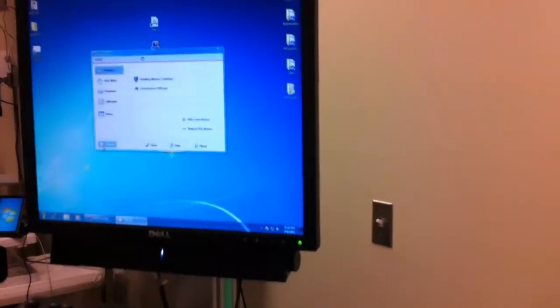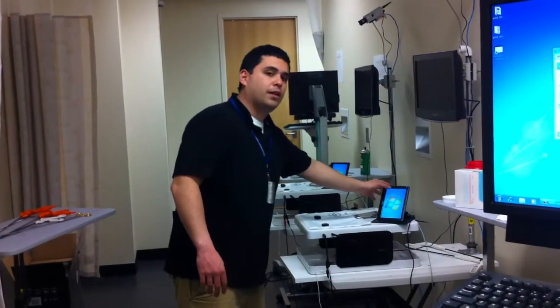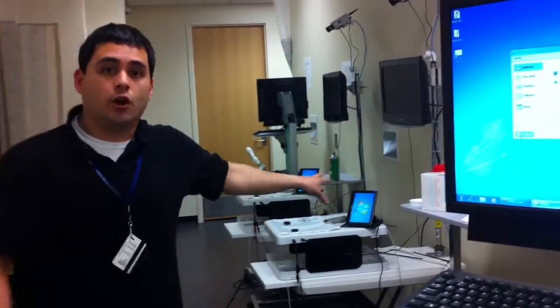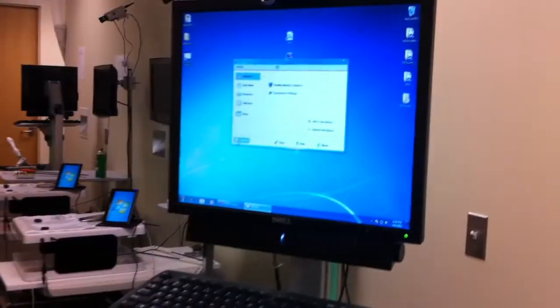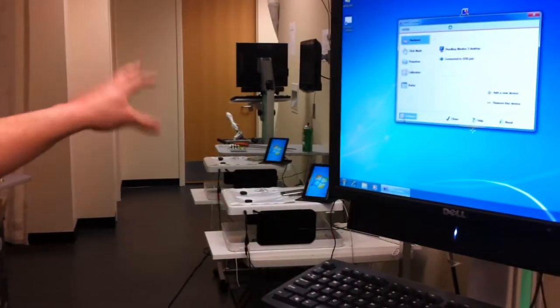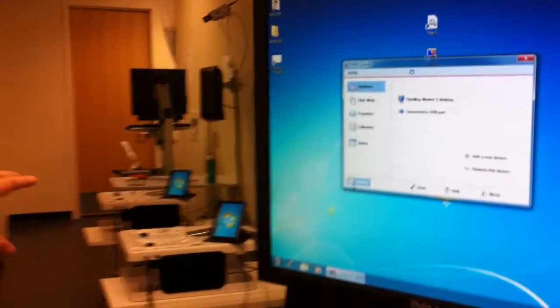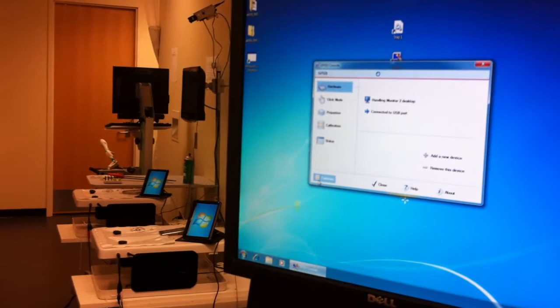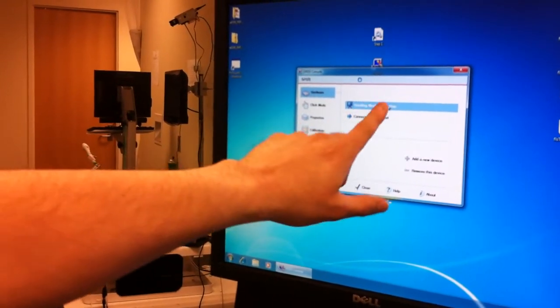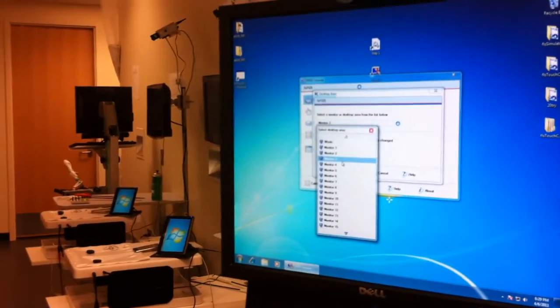You heard it click. So now we know it's this one right here because when I touched on the screen on the top left, where normally that crosshair would be, we heard the machine click. So we know that it's that device. So now what we need to do is make sure that we get the proper monitor handling on that device. Okay. So I'm going to drop this down. We knew it wasn't 2 because when I pressed calibrate, it wasn't there. So I'm going to drop this down and now choose monitor 3.